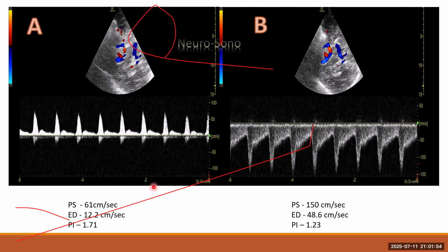So this is an image depicting the regional variations in the ICPs with the help of TCD, which is its own speciality of analyzing TCD waveforms, indices and velocities.